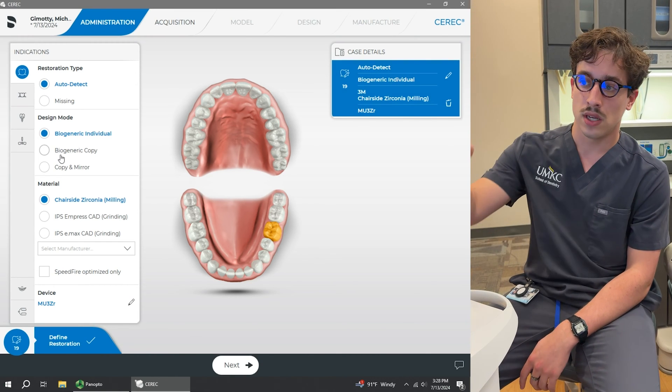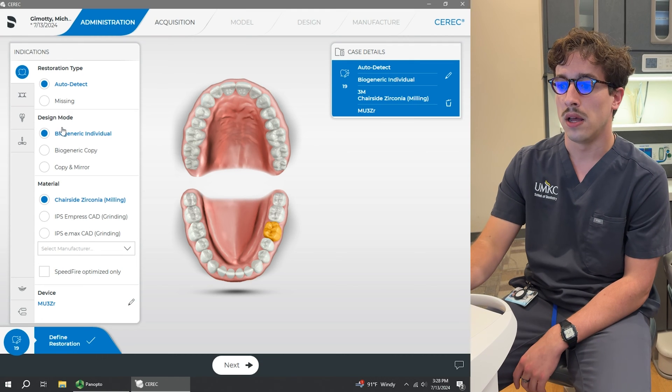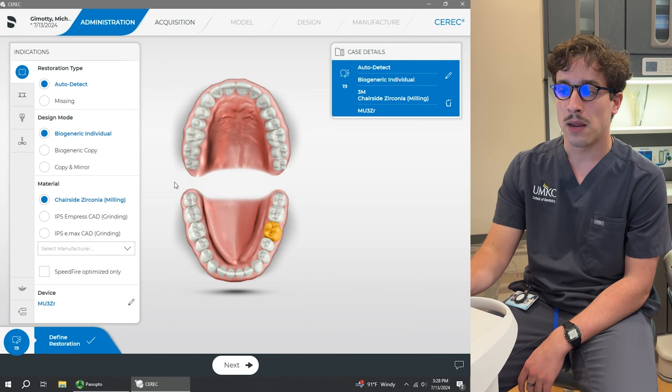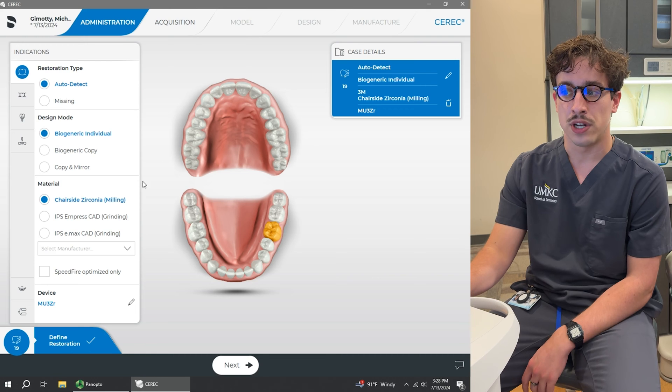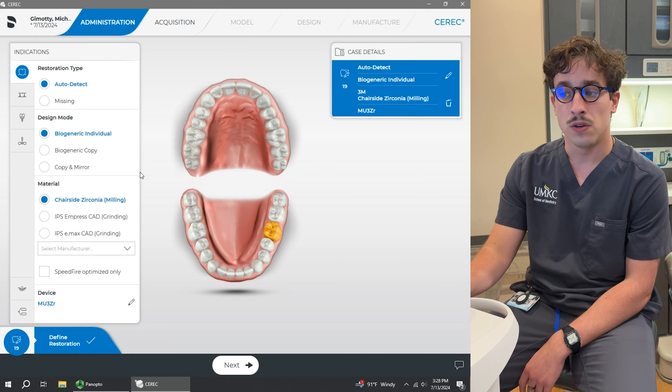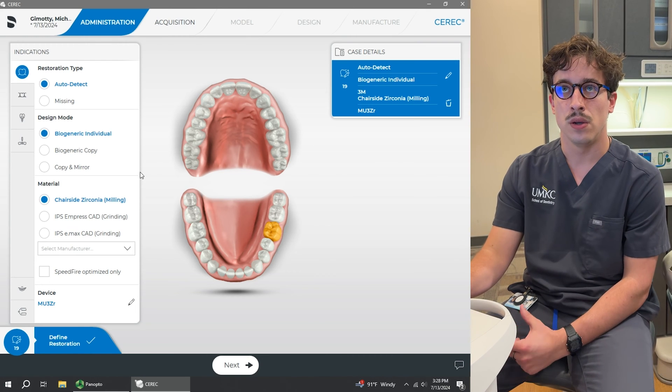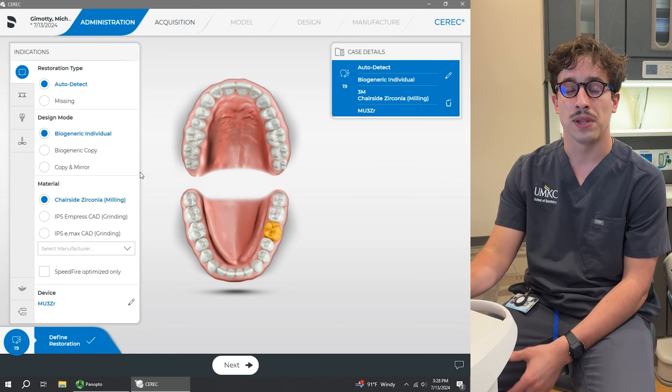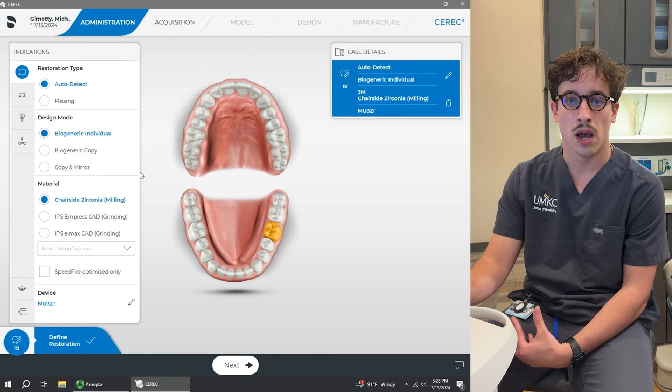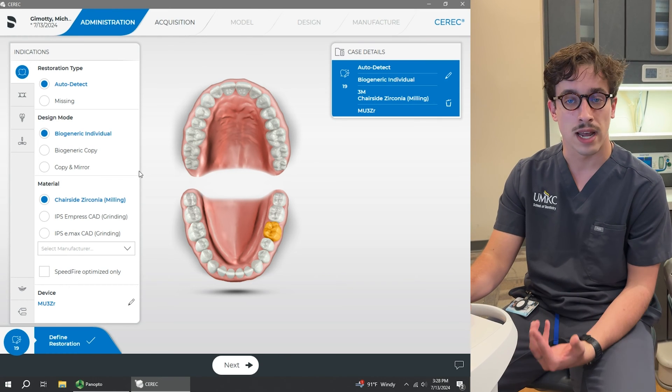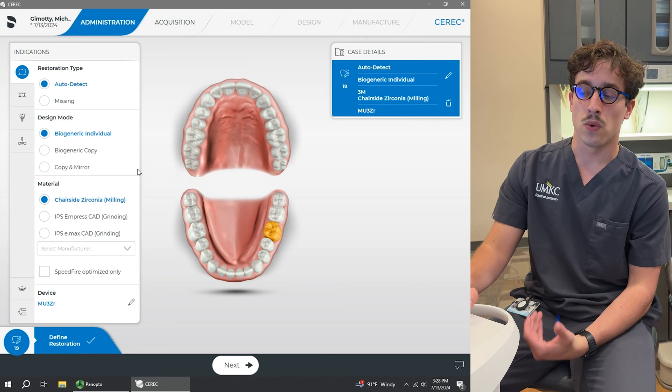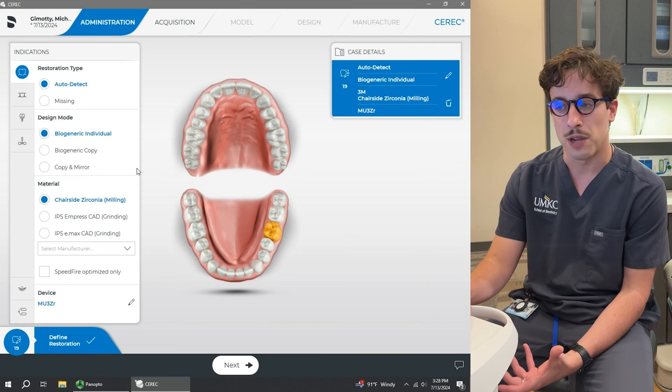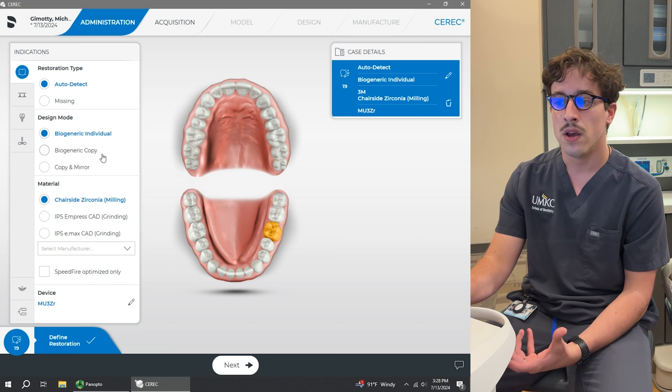So on the left side, you can see that we have a lot of design modes. What we're going to be doing 99.9% of the time is biogeneric individual. We can do biogeneric copy if we wanted to, let's just say replicate exactly what the tooth was before we scanned it. That gives us that ability. But most of the time for what we're seeing is that we're not copying the exact shape of the tooth and the exact anatomy.